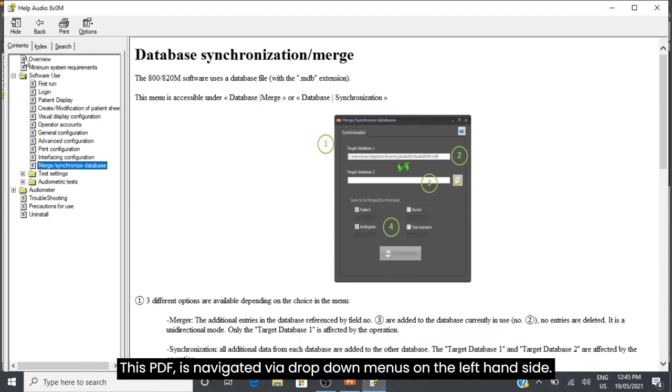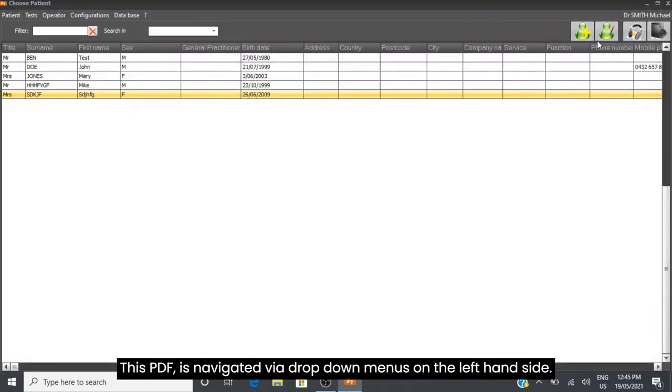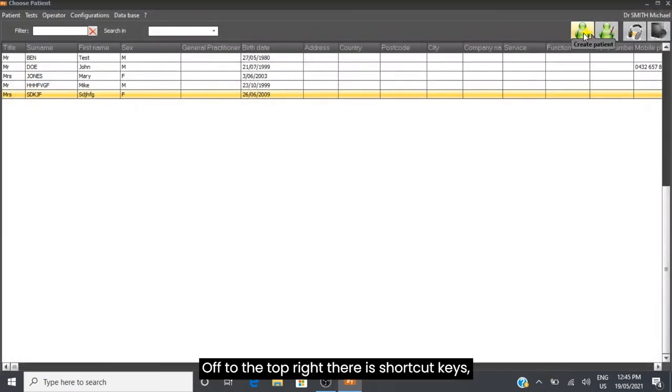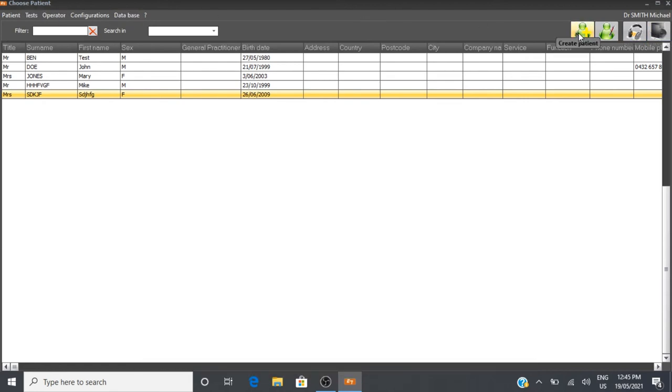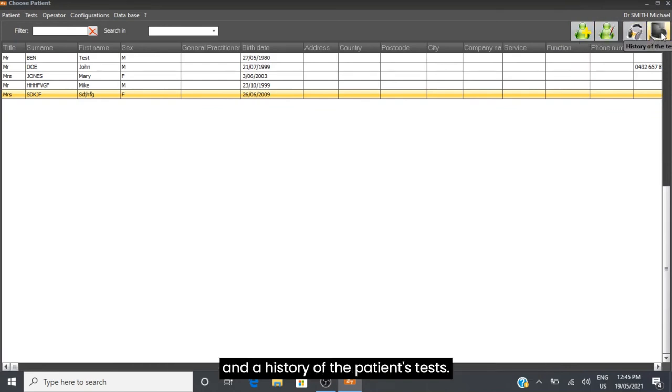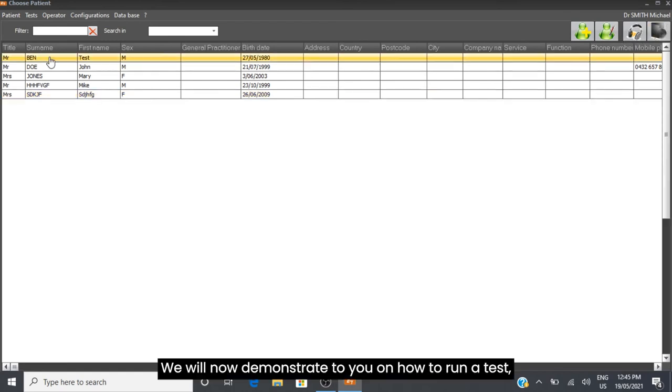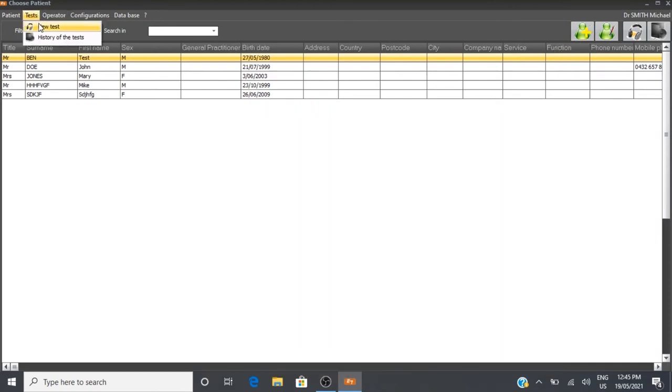This PDF is navigated via drop down menus on the left hand side. On the top right, there are shortcut keys where you can access the most vital menu settings: create a new patient, modify patient details, start a new test, and view history of the patient's tests. We will now demonstrate how to run a test, which you can do either from the shortcut buttons or in the menu.